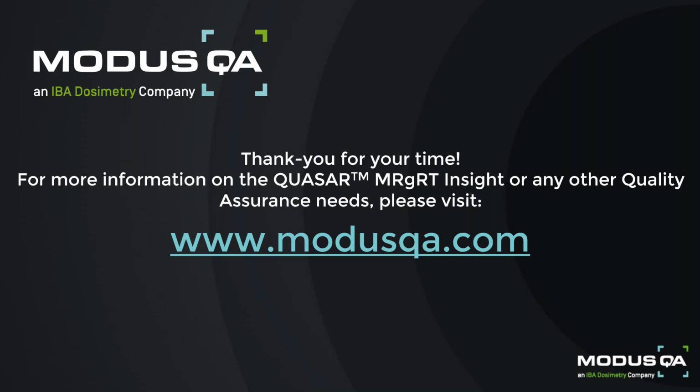Thanks very much. Our next question from this participant says, I currently use your 3D geometric distortion Phantom. What's the difference between the Insight and the one I currently have? Okay, great. Thank you very much for the question. Just so we're all on the same page, our distortion phantom is the QUASAR MRID 3D, and that is our large field of view hollow boundary phantom, and that can be used to assess geometric distortion in 3 dimensions, hence the name.